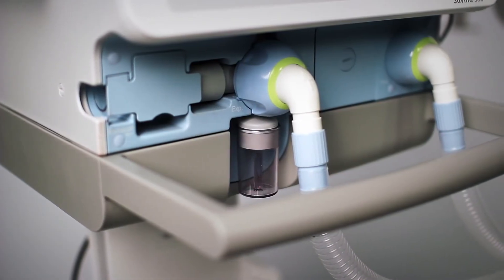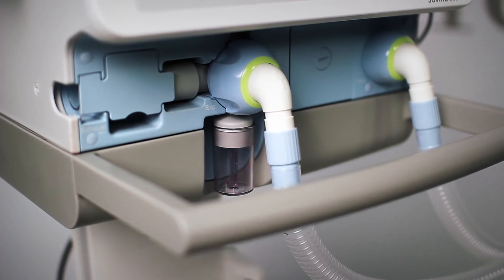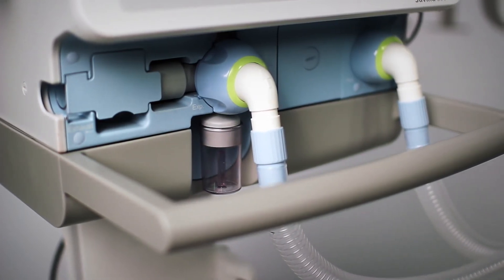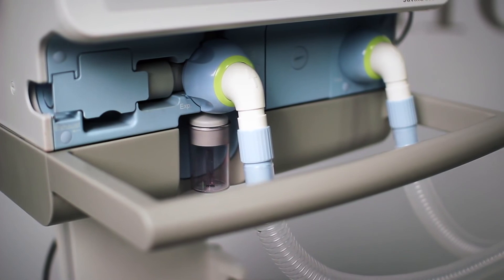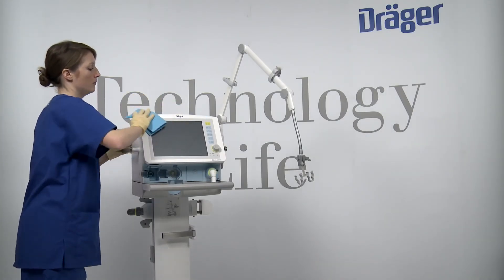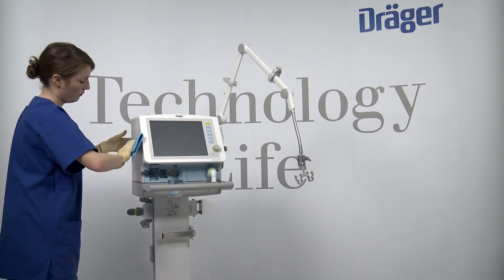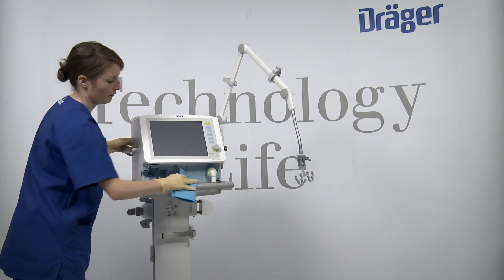After cleaning and disinfecting, always dry the expiratory valve by means of hot steam sterilization at 134 degrees Celsius or 273.2 degrees Fahrenheit, to ensure that all remaining liquid is dried completely in the interior areas. Now wipe the surfaces with a clean, damp, lint-free cloth without using corrosive detergents.